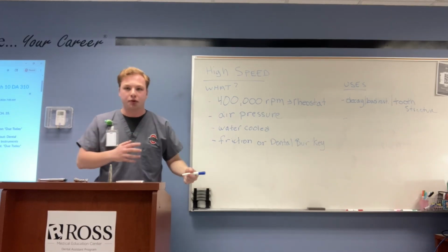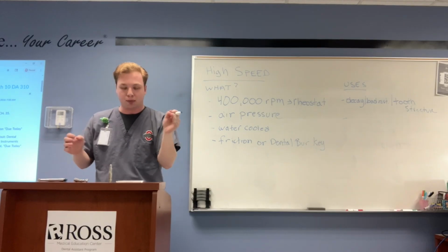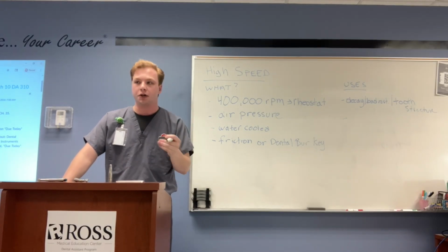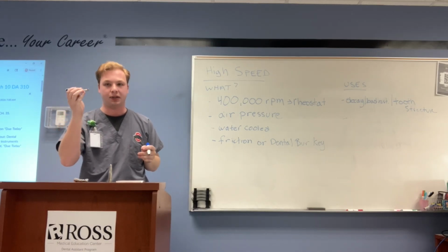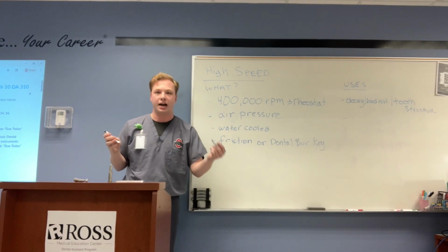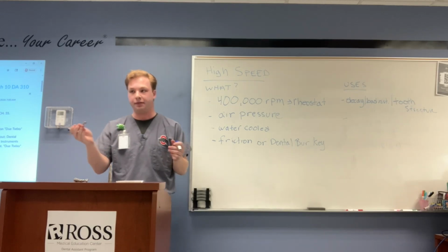So a lot of similar things, but remember, we're moving a lot quicker. So it's a lot faster, it's a little more technical, right? It takes a lot of years of practice and training being able to master the high-speed handpiece. That's why it takes dentists so long, so many hours and hours and hours of practice just to get the dexterity to be able to use it safely in the mouth.